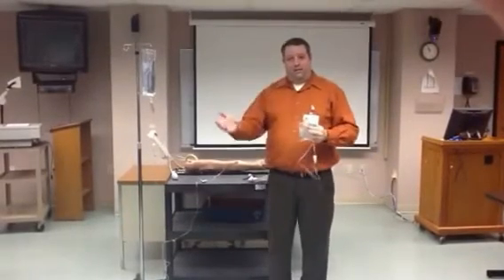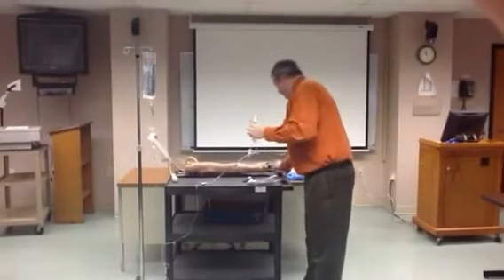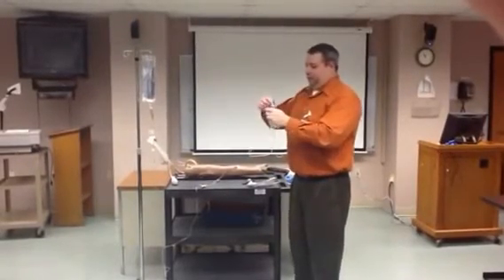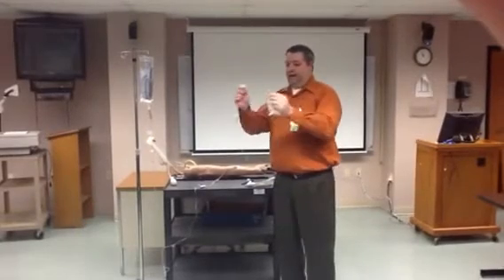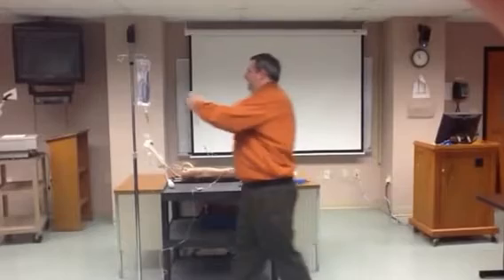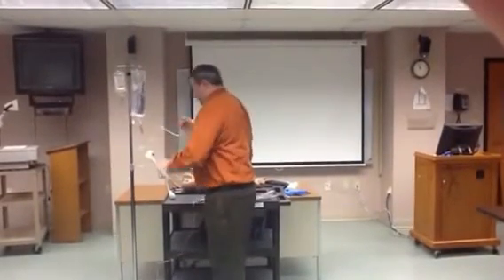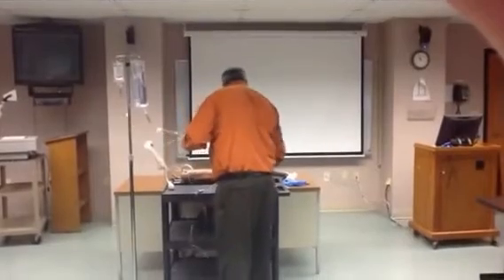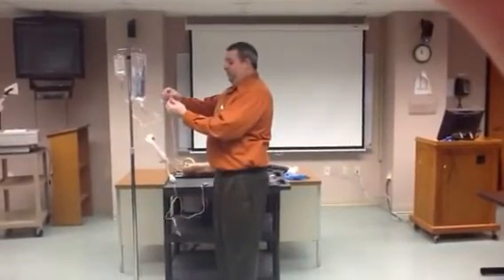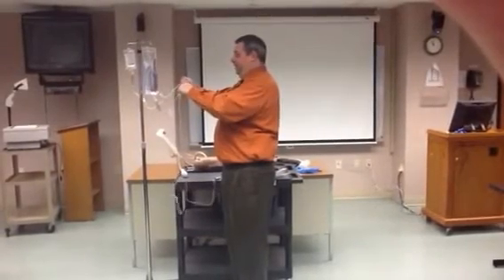We've done all our math and everything's good to go. We're going to remove the port cover and spike the bag. Now we're going to hang this on the pole. We're going to take our alcohol pad, clean this port, remove the cap, and then insert it.